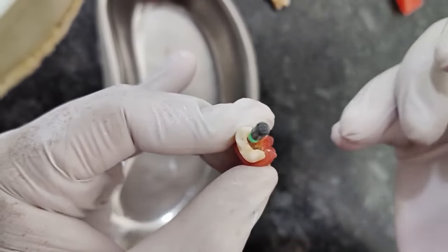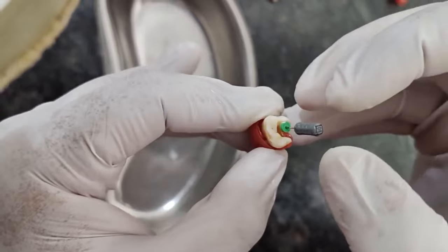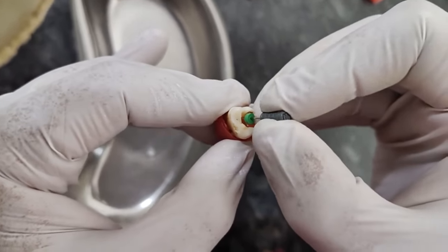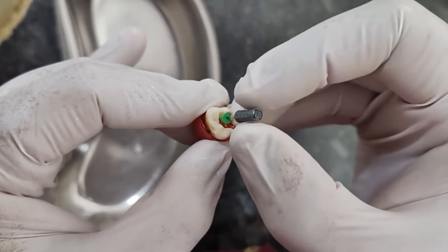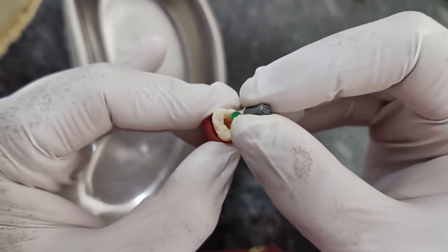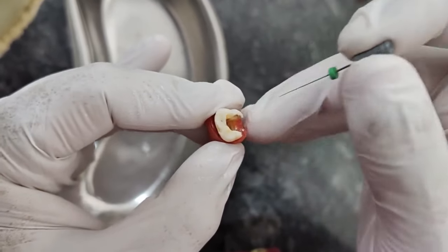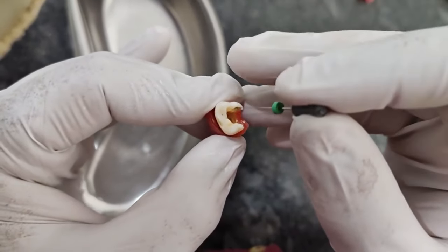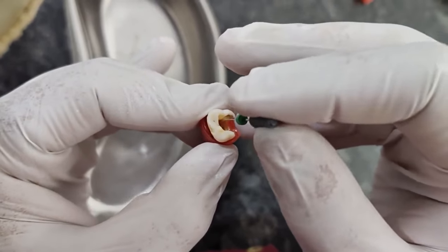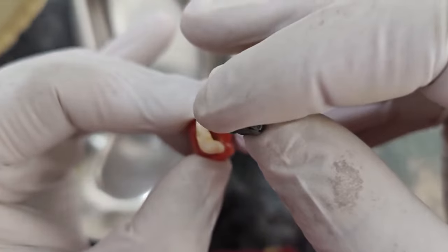So this is the mesobuccal canal of the tooth. And see the angulation. You have to give a slight angulation, and then we have to insert it in the canal. So this way we have to make a straight line access. Once you are done with the number 8 file, you should not re-enter it. Rather, you can find the other canal. This is the distal canal, which is just lying distal to it.